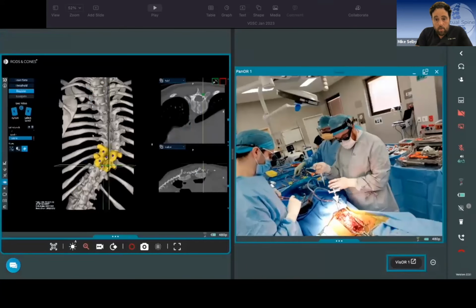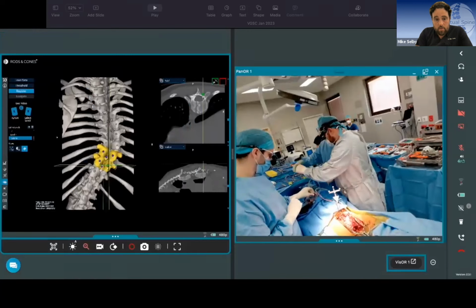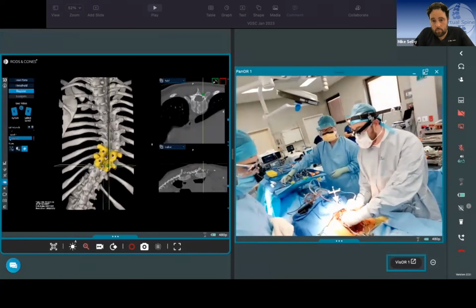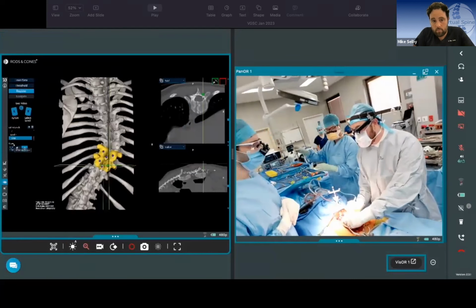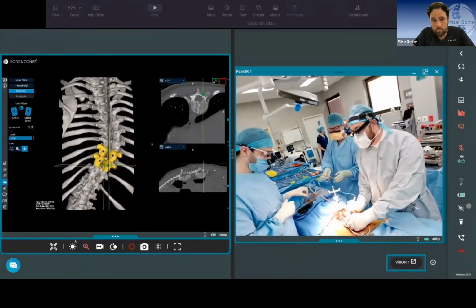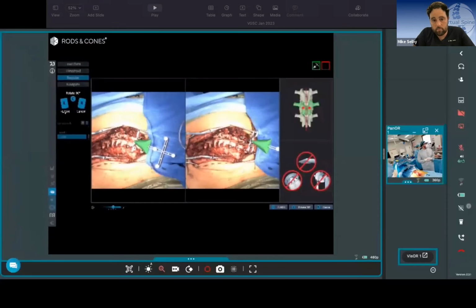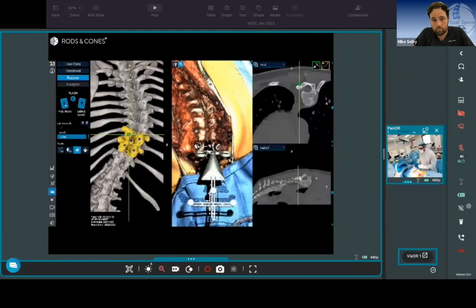Very small particles, let's just get maximum accuracy. So here, it's 2 segments. Yes, one segment gives you the most accuracy, but if you've got obscured vision, sometimes it doesn't. So I reckon in general, 2 segments is really accurate. If the spine's very stiff, you go 3 segments. Clamp on 10? Yep, clamp's on 10. Just wait for it to stop bouncing. Nice. Okay, you ready? Ready.